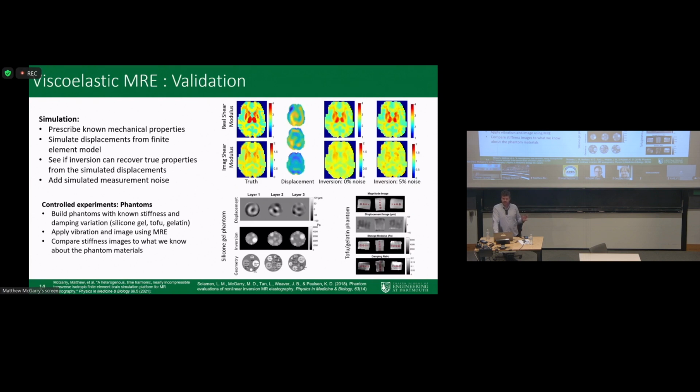You'll notice that these images don't look as clear as some of the typical medical images you'll see, like MRIs. The main explanation for that is that we're trying to image sub-wavelength. Our wavelength is on the order of 30 millimeters, and we're looking for things on the order of 8 millimeters. So it's kind of a near-field versus far-field problem. It's a lot more difficult. That's why we need to go into these more complex finite element-based model fitting approaches.